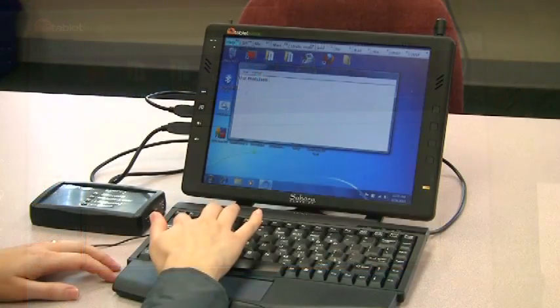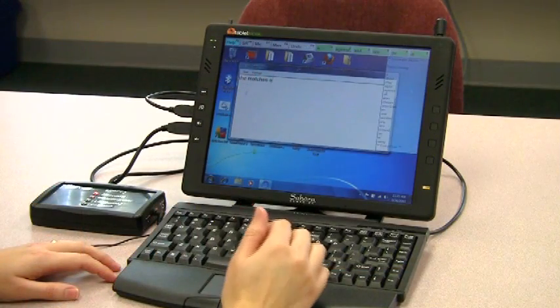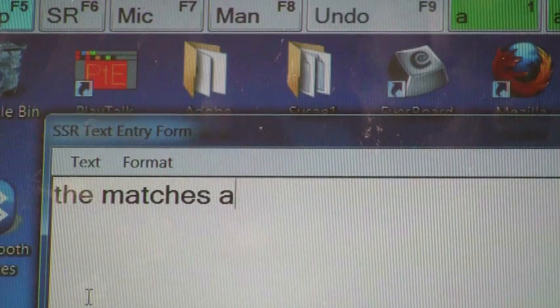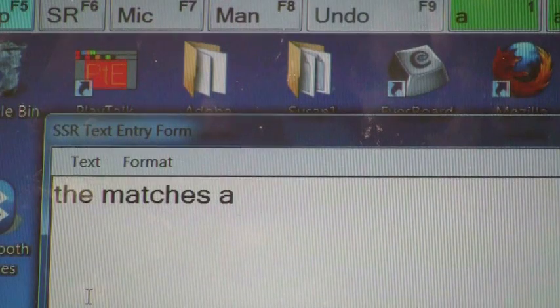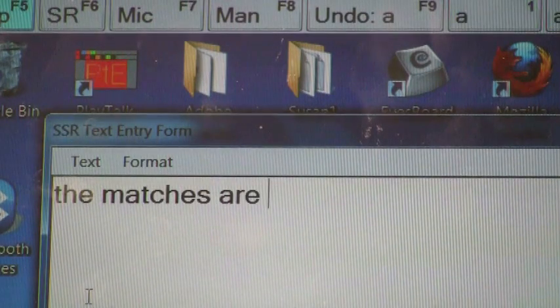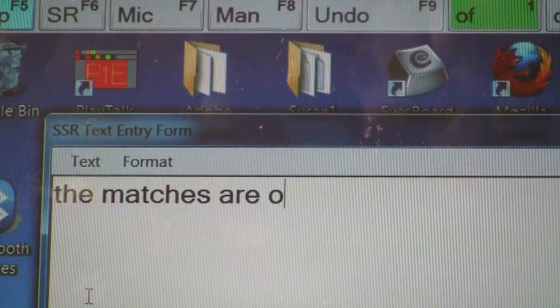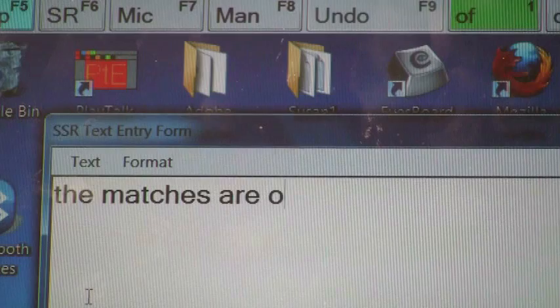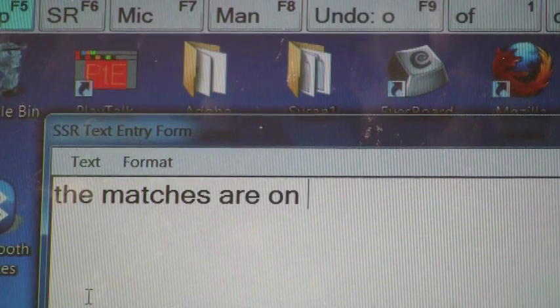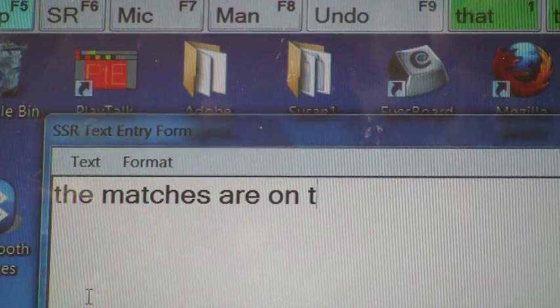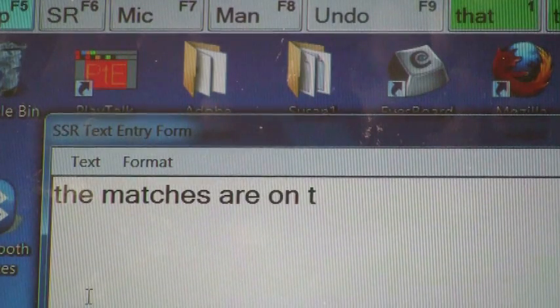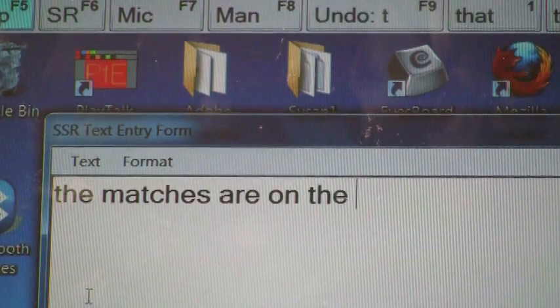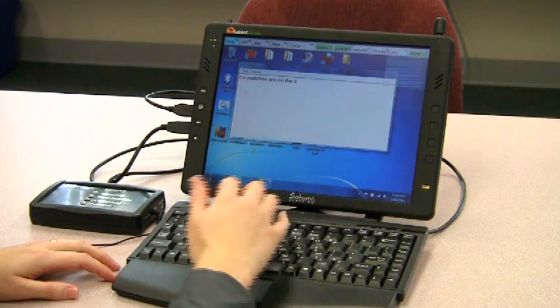While SSR will type into any editing software, the software includes a simple text editor for evaluation purposes. This editor enables the SSR software to accurately monitor user activity and calculate keystroke savings and typing rate.